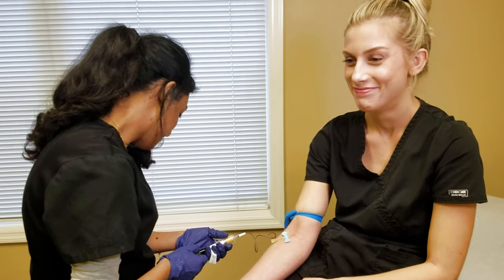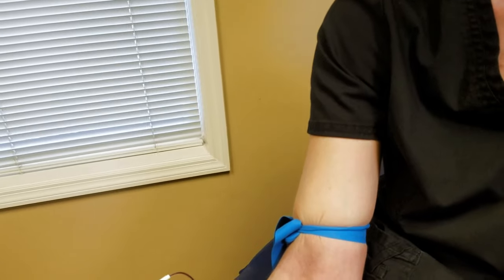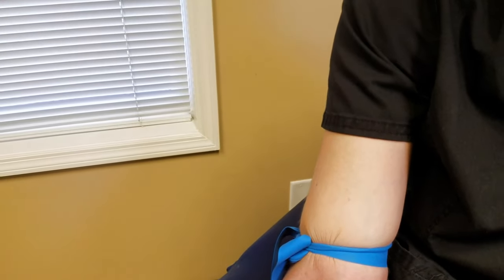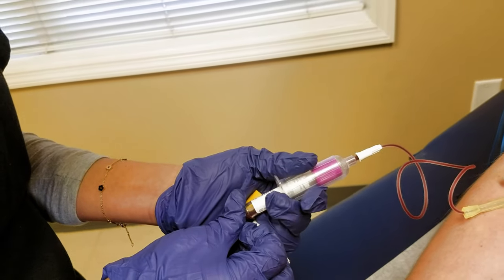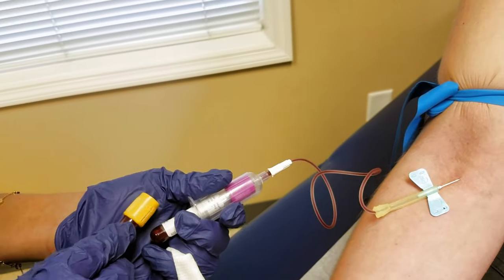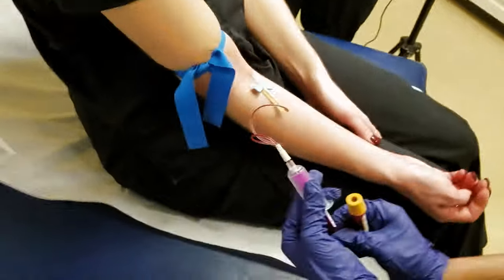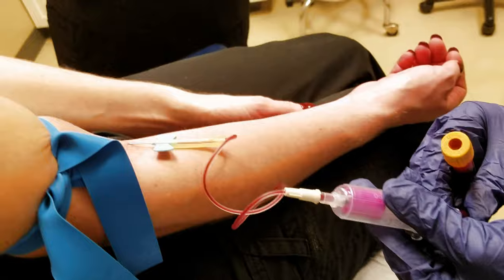As your blood tube is getting almost full — and it is — after it gets to this level, it's pretty close to being full. Go ahead and swap it out; push that one in. When it gets up to the white line, hold it vertical. As it gets up there, you can go ahead and undo the tourniquet since this is the last tube. Pop your tourniquet.